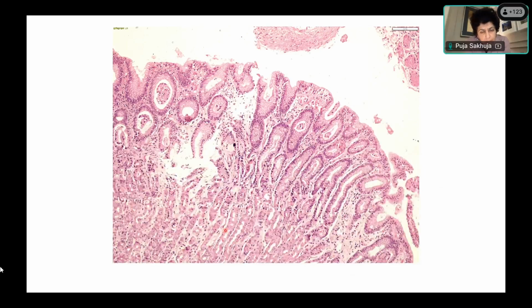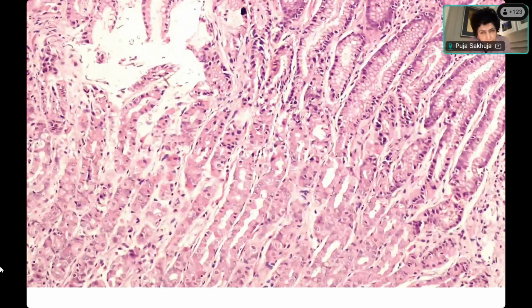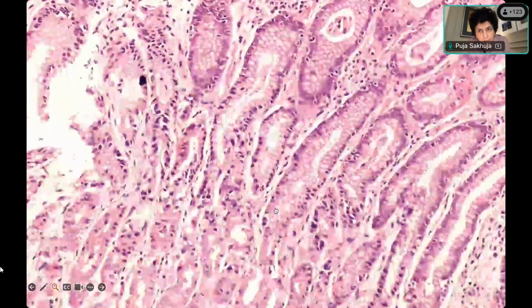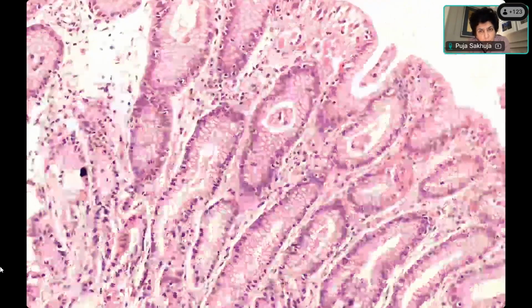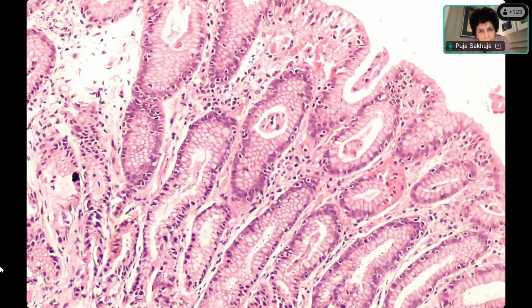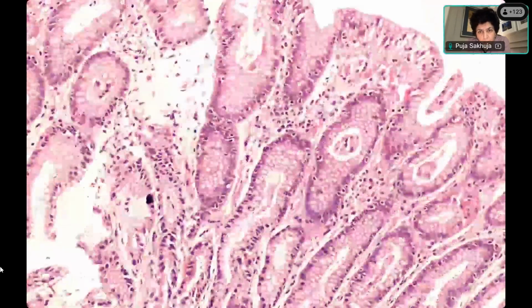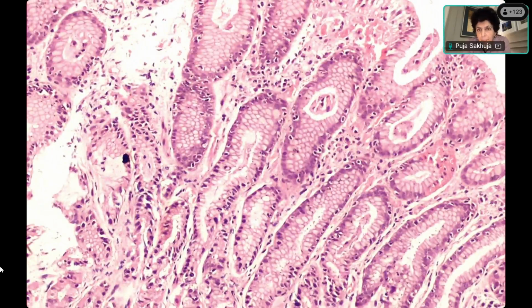Okay, let us see this area. Is this seen in the colon? You have two parts of this. One is this upper part and one is this lower part, right? Yes, ma'am. Now, Ramni, just describe this upper part. Now what you are seeing, without worrying about anything else. Whatever you have written earlier, forget that. Now tell me what you are seeing in this field.